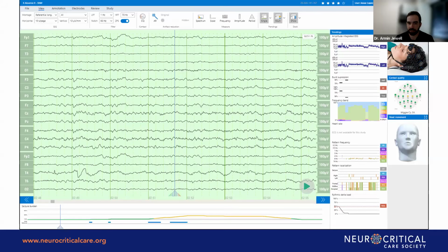And on the right, also there are different analysis tools that they have, including the frequency bands and the AI EEG and things like that on the side. But there's different versions of AI that are used to help with bedside analysis. And again, of course, as I mentioned in the last slide, human oversight is important, and AI is a tool to help us, but needs physician oversight to ensure it is truly status versus not.